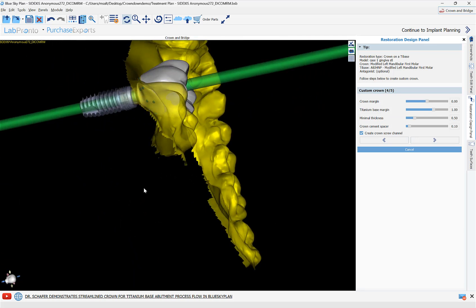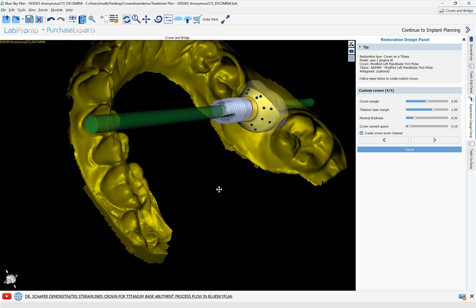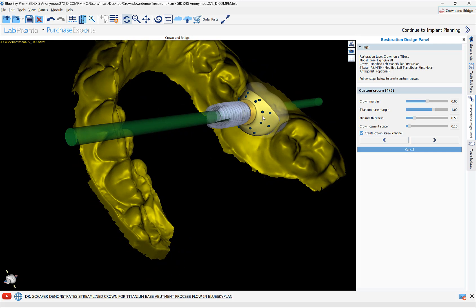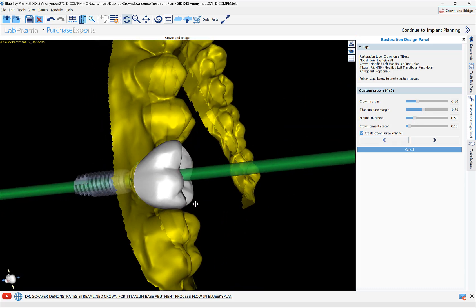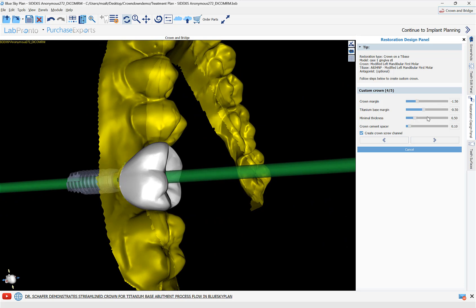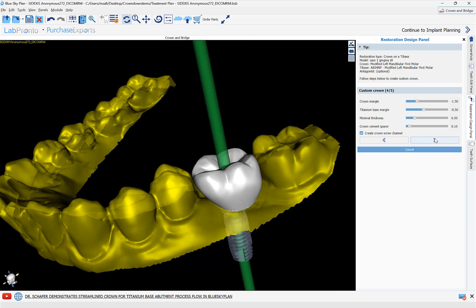We can now see that the connection has been created between the crown and the titanium base. At this step we can adjust it by grabbing any of those nodes and dragging them. We also have sliders: the Crown Margin slider adjusts the crown margin; the Titanium Base Margin slider controls the connection between the crown and the titanium base margin; Minimal Thickness ensures at least 0.5 mm of crown thickness; and the Crown Cement Spacer sets the adhesive space between the titanium base and the crown. There's also a checkbox to create a crown screw channel, which can be toggled on or off. Click Next.